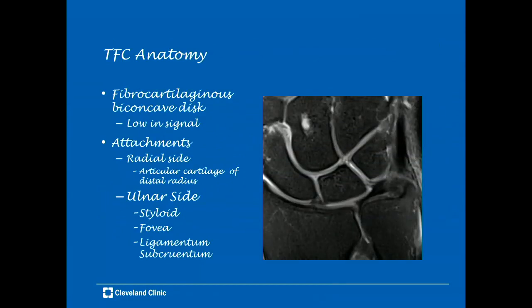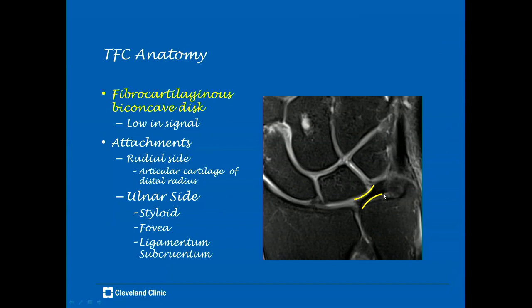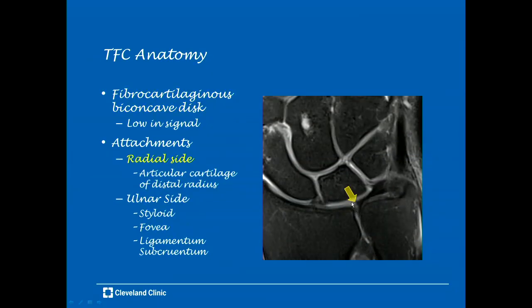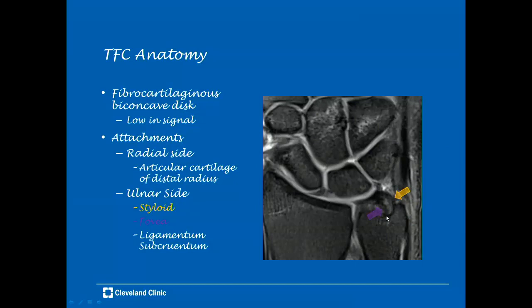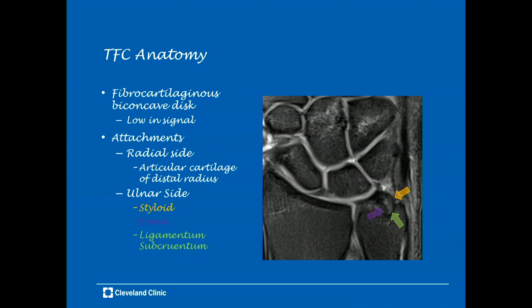A quick review of TFCC anatomy is important to distinguish pathology from normal. The disc is a biconcave fibrocartilaginous disc that should be low signal on all pulse sequences, similar to the meniscus of the knee. Its radial-sided attachment to the distal radial articular cartilage can be high in signal and should not be mistaken as a tear. It has two ulnar-sided attachments — to the ulnar styloid and the ulnar fovea — with a high-signal area in between called the ligamentum subcruentum, composed of fibrovascular tissue, which is normal and shouldn't be mistaken as a tear.